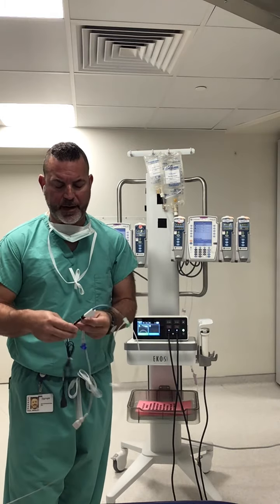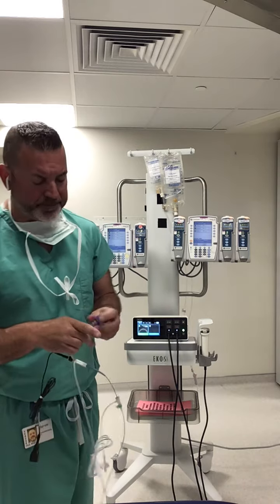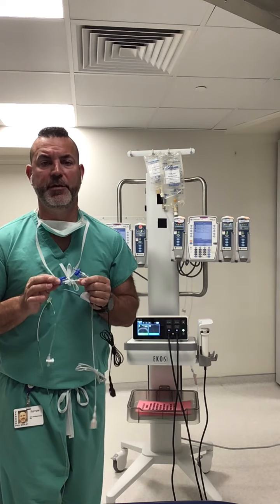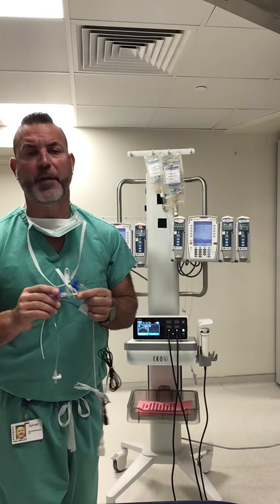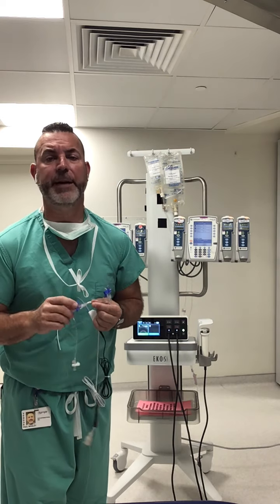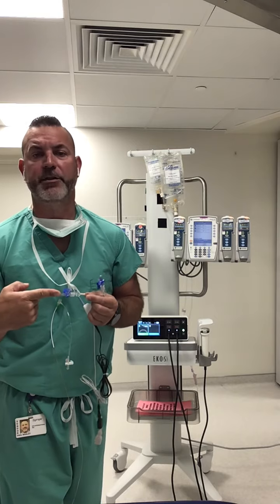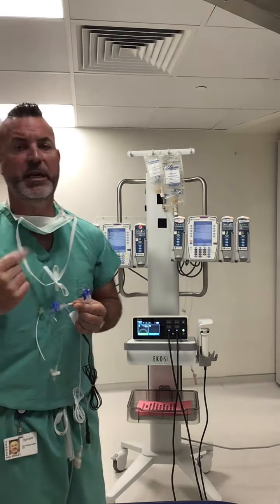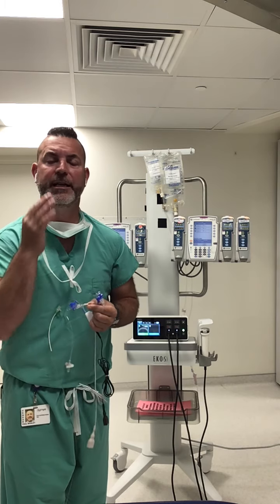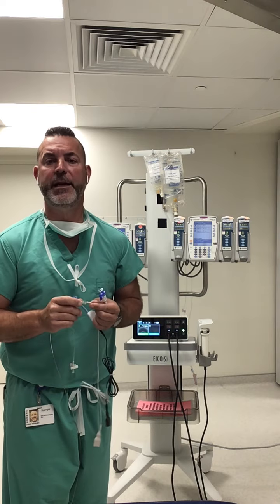Okay, so let's talk about our normal saline and our TPA. When we're talking about our drip rates, our studies have shown between 0.5 to 2 milligrams of TPA per hour in our PE cases, our arterial and our DVT. However, it's physician prescribed. What I've seen across the country is 1 milligram an hour through our EKOS catheter. 1 milligram an hour for a PE patient, 1 milligram an hour for our DVT and our arterial. But again, it is physician prescribed. They may prescribe 0.5. It is whatever they feel they need to do to treat their patients.